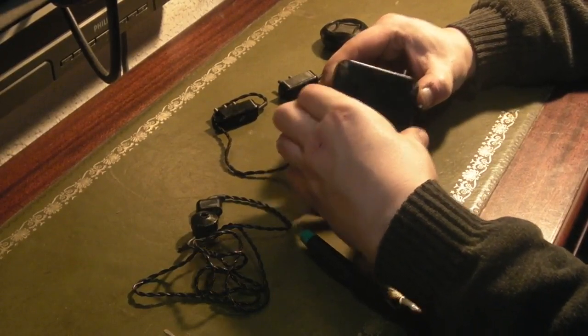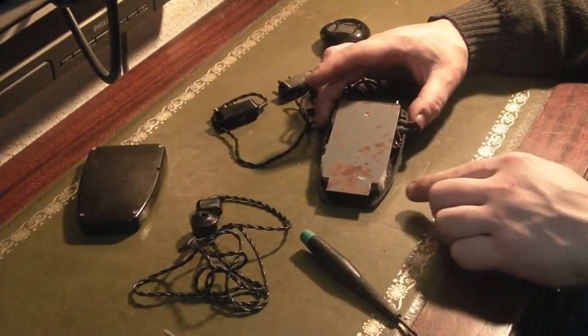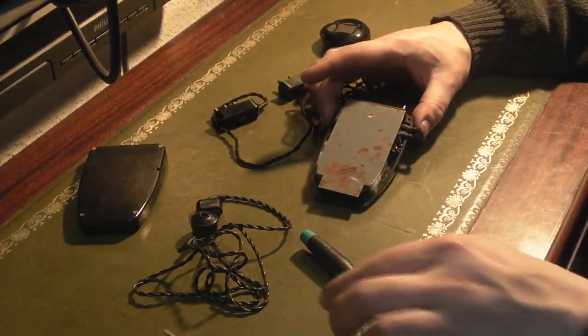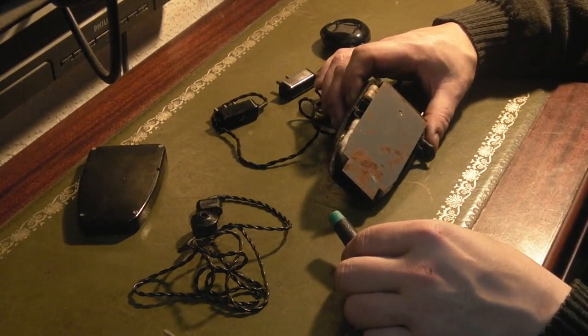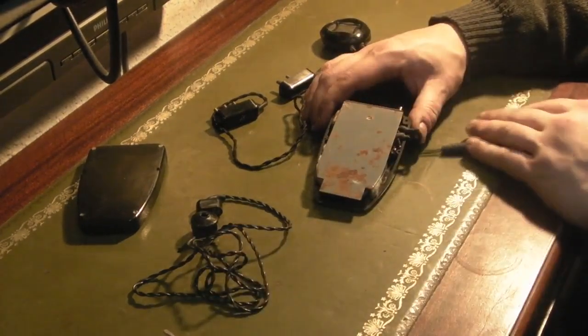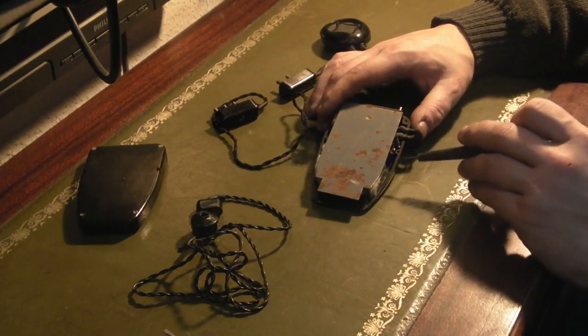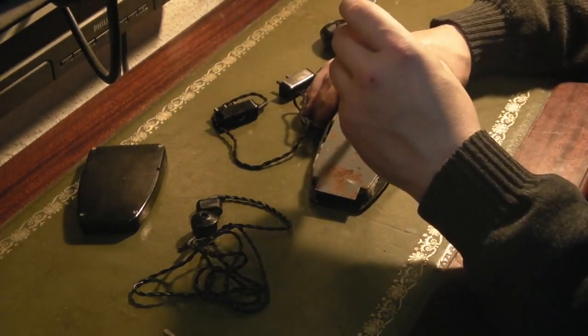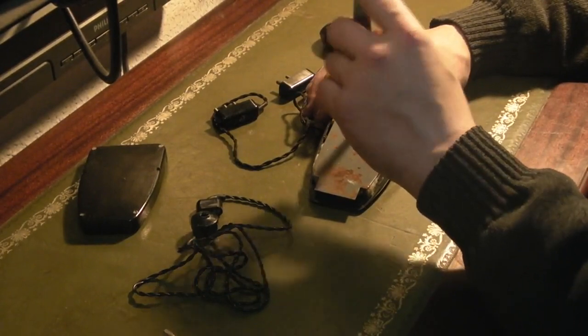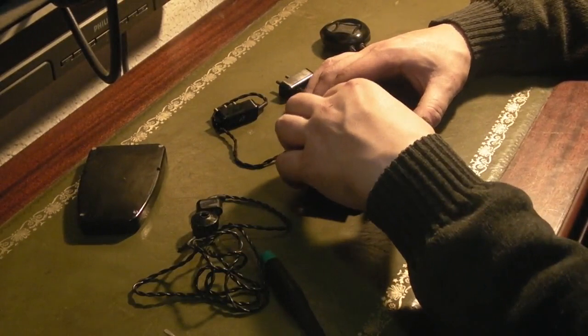There we go, we're in. It's a little on the rusty side in here, as we can see. Let's see if we can get in there a little bit further. I can see the valves — valves in the UK, tubes in America. I can see them under there and they do indeed appear to be the wire-ended variety.